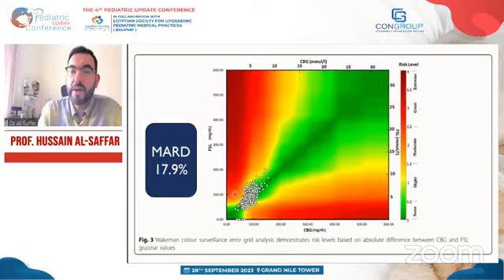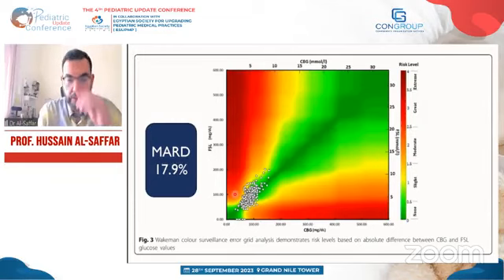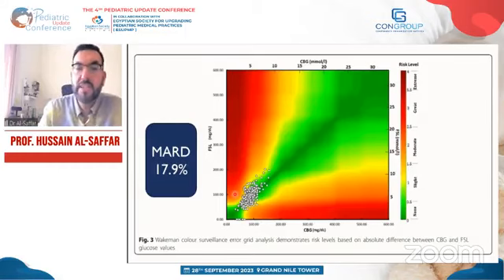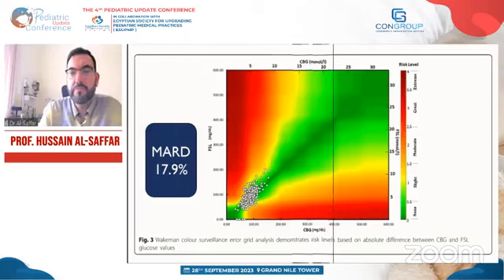However, the parents were very happy to use this type of glucose monitoring to know the trend of the glucose of their kids, what's going to happen to them, and what the prediction is going to be.